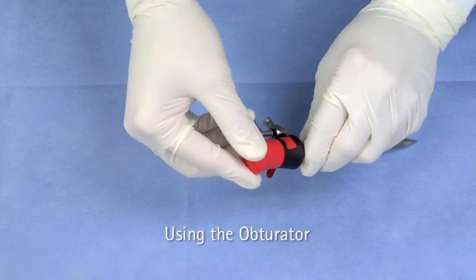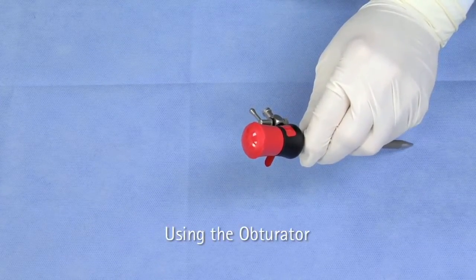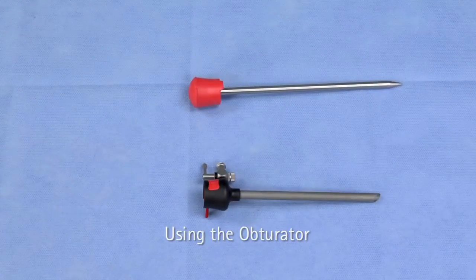When ready for use, the obturator securely fits into the sleeve by positioning the notch into the opening in the rim of the trocar head. However, the obturator must remain outside the sleeve during sterilization.